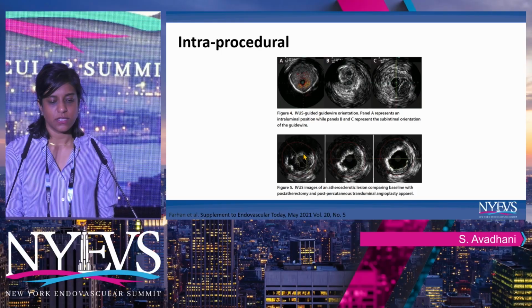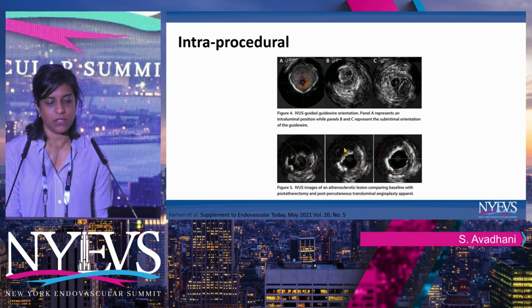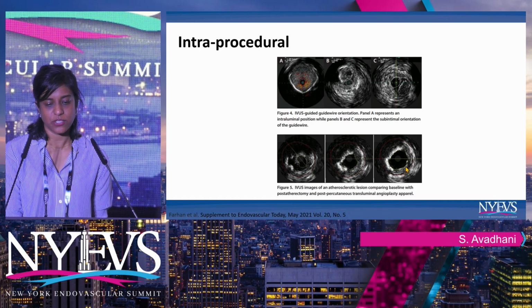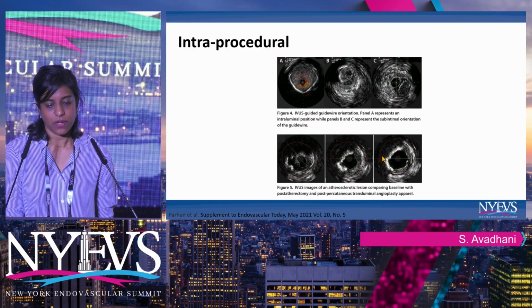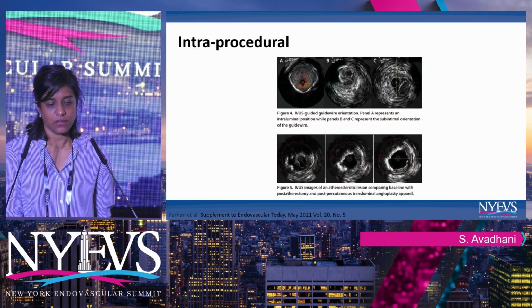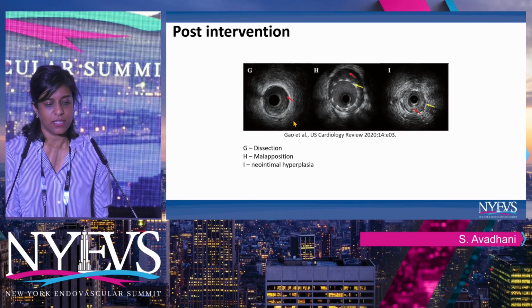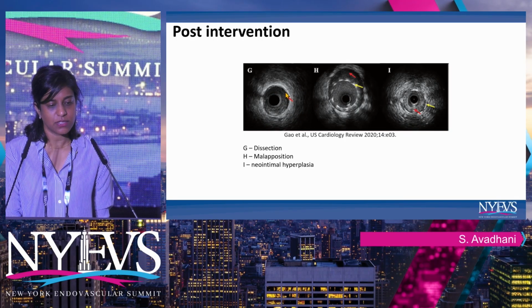Here, this was our original lesion post-atherectomy. You have some amount of luminal gain, and then after balloon expansion, it also helps us gauge the efficacy of our intervention as well. Post-intervention, it helps us figure out any complications.